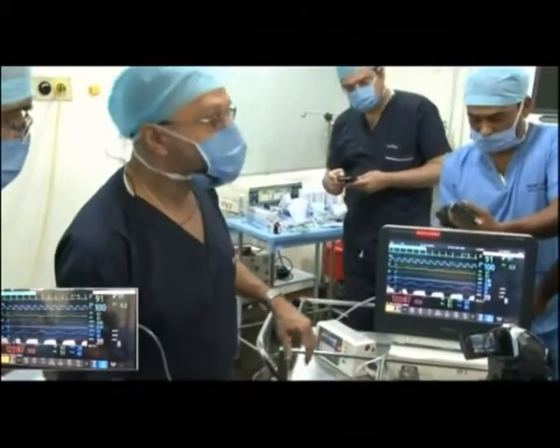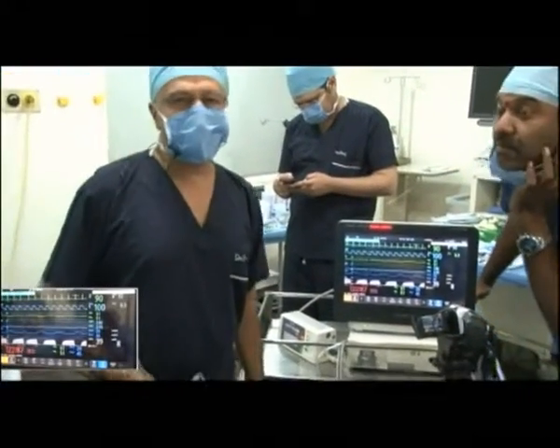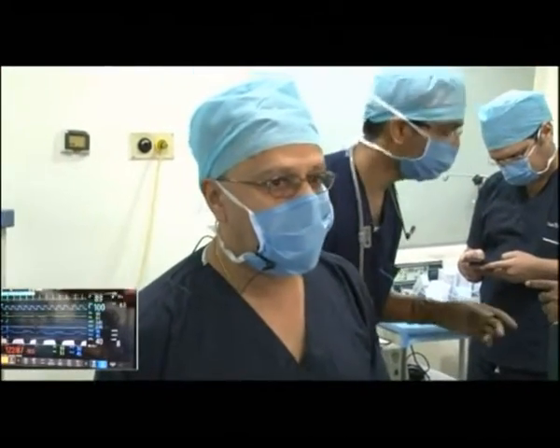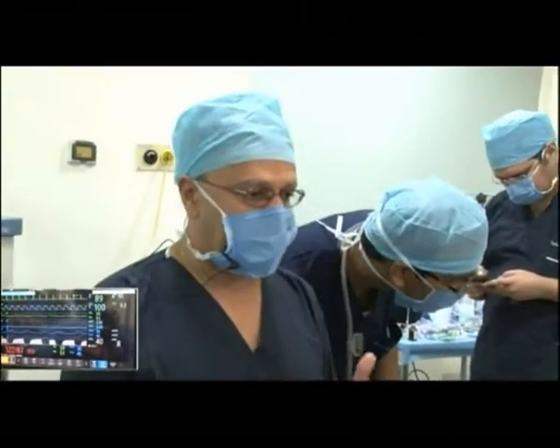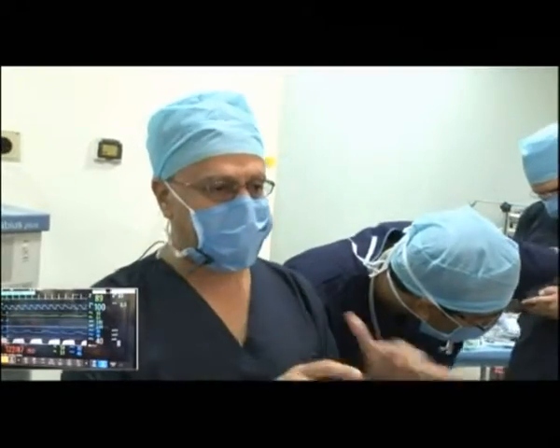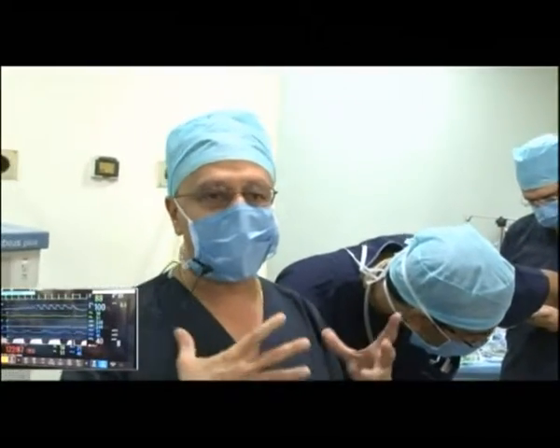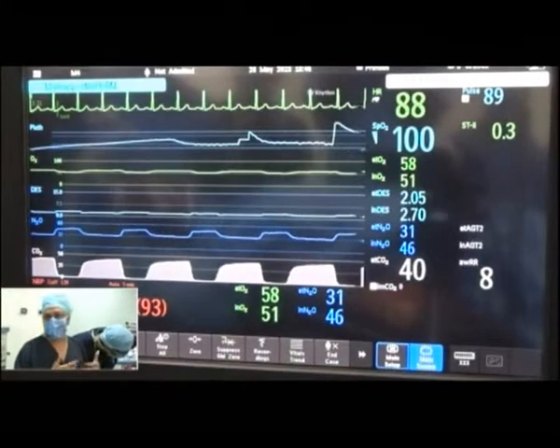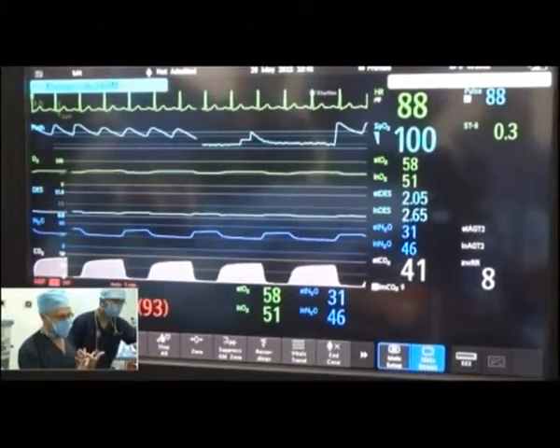Dr. Joshi, do you spray the cords before you intubate normally? No, I'm assuming you're asking about spraying with lignocaine, correct? That's right. Yes, no, there is really no reason to spray. In fact, in the old days we used to do that. Now there's good data to suggest that, A, it's not necessary. As you see, the blood pressure has not changed, the heart rate has not changed. And spraying itself can actually stimulate the cords and cause more increase in blood pressure and heart rate, hemodynamic stimulation. And it's actually not necessary.